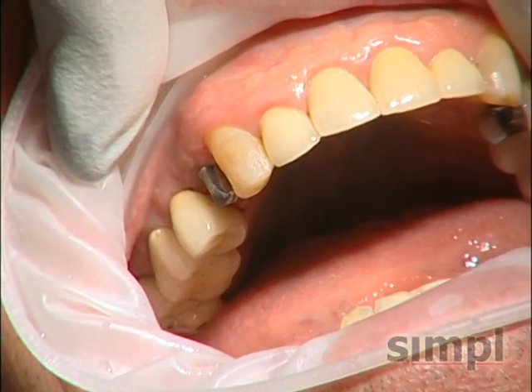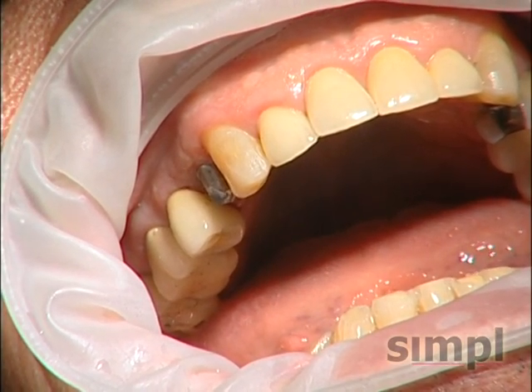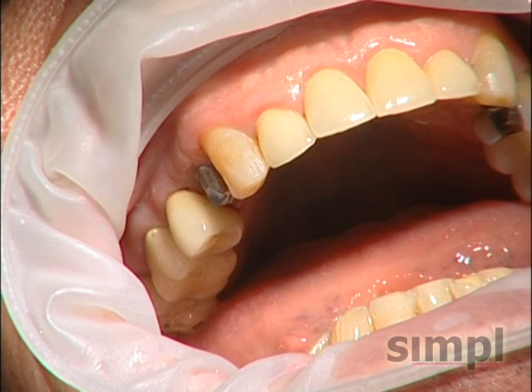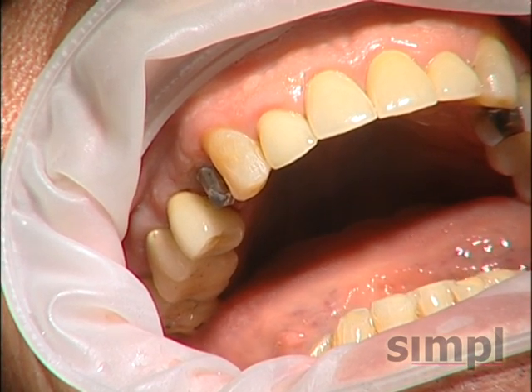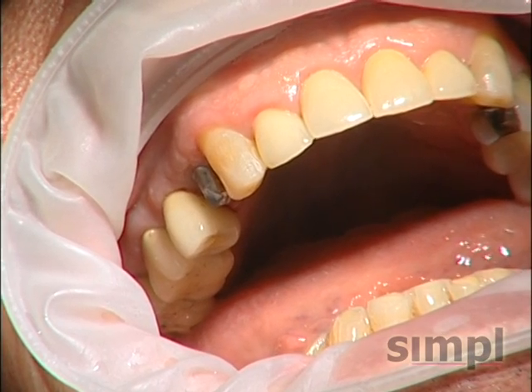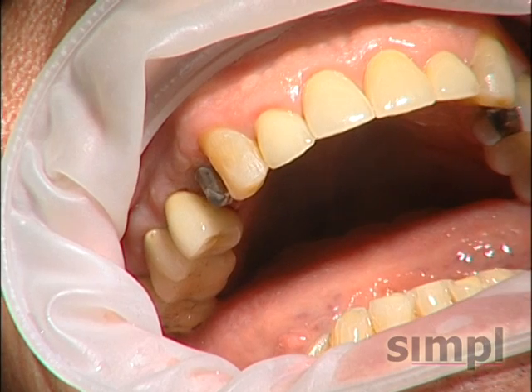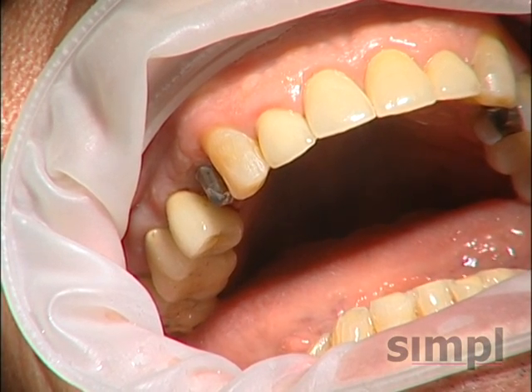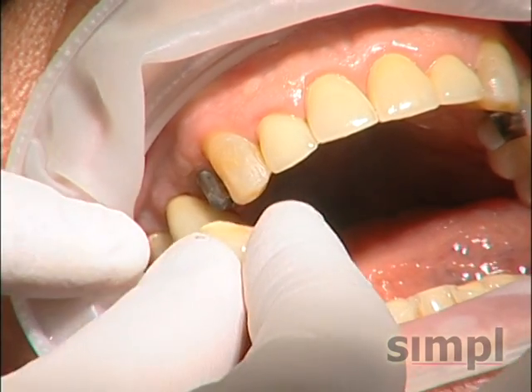And now we're going to choose to cement the crown with Duralon and a little Vaseline. And that way it's on there pretty secure, yet we have the ability to remove the crown in case something may happen. The screw loosens up a little bit. If it was an all-ceramic crown, most likely we'd cement this in with a resin cement.